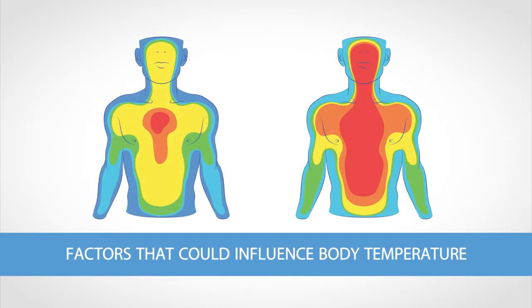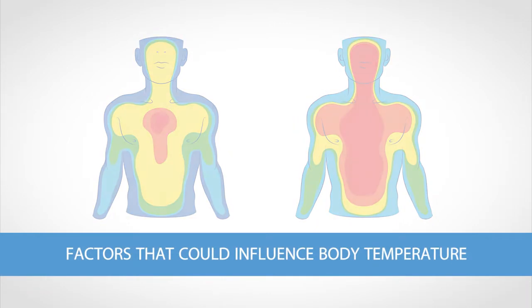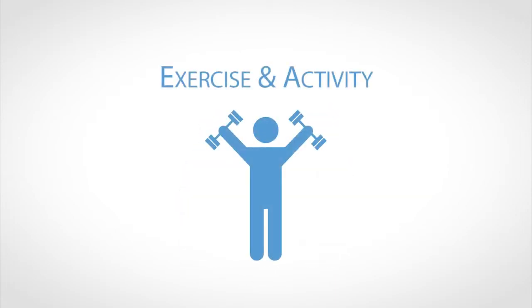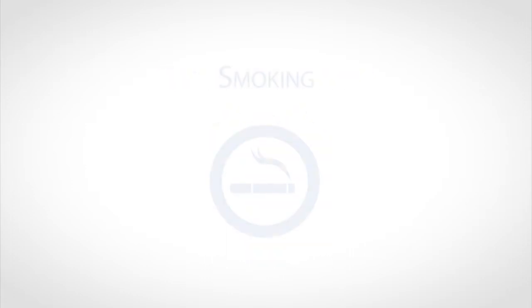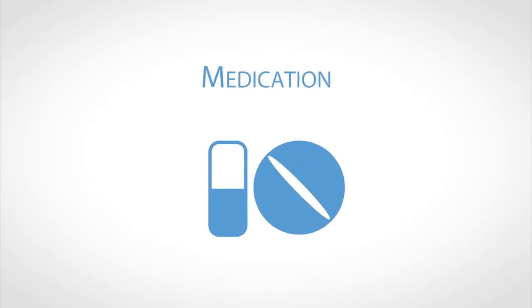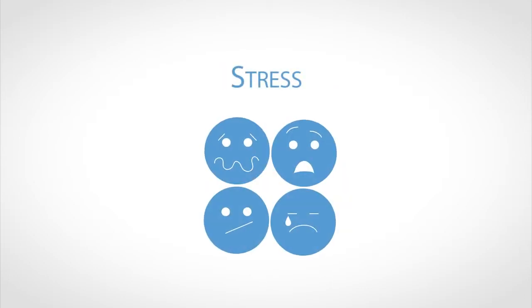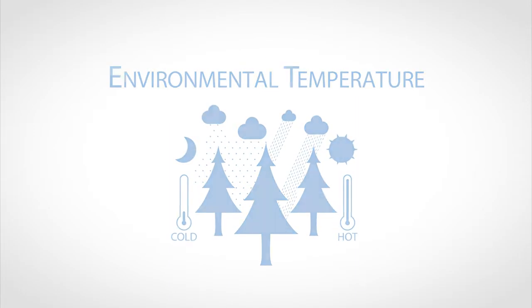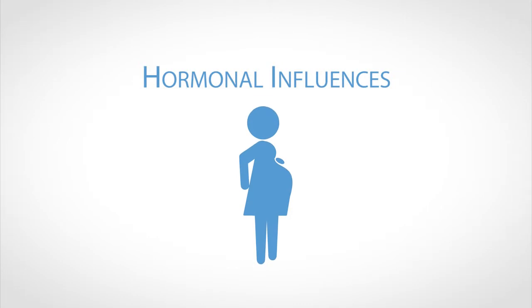Assess the following factors that could influence body temperature: age, exercise and activity, smoking, medication, stress, illness and diseases, environmental temperature, and hormonal influences. Determine the appropriate site to be used for assessment of temperature according to the patient's age and condition.